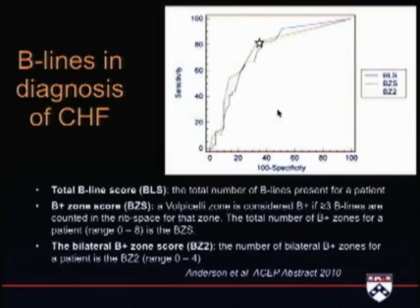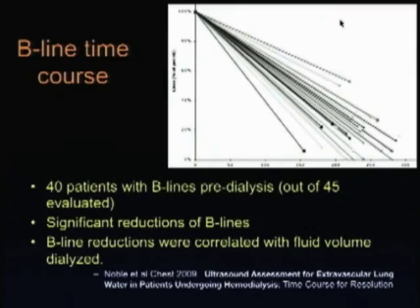And the composite clinical endpoint was extracted by 2 independent physicians, making an impression whether or not the patient had been in congestive heart failure at the time of the exam in the emergency department. All these techniques performed very similarly with respect to the receiver operator characteristic curves, as can be seen in this picture right here. Another interesting investigation that's been done of this by Dr.